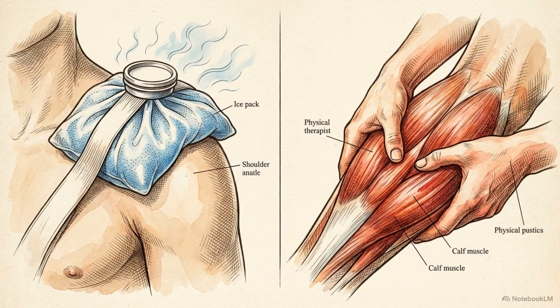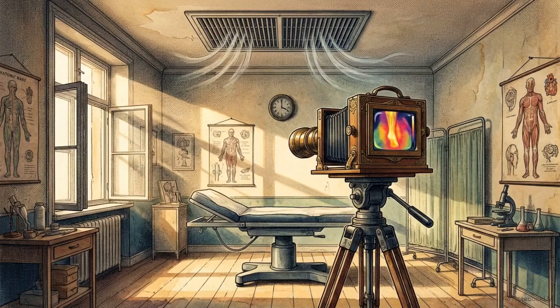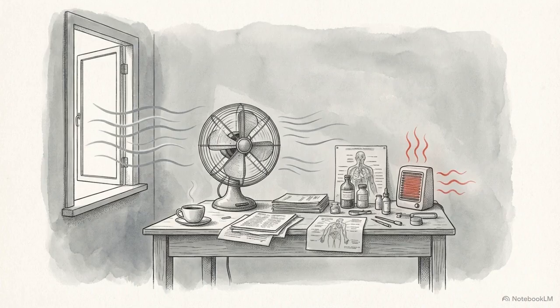Clinicians also use infrared thermography to evaluate the immediate physiological effects of therapeutic modalities, like cryotherapy or manual massage, tracking subsequent shifts in skin temperature. Thermography captures acute localized inflammation and broad compensatory fatigue before a patient reports classic clinical symptoms. Because this technology measures minute surface temperature variations, it is highly susceptible to environmental artifacts. A thermogram taken in an uncontrolled environment yields clinically useless data, necessitating strict laboratory standards for image capture.